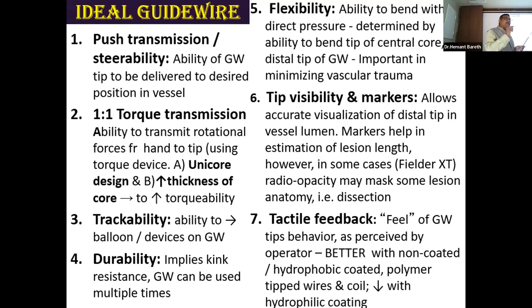That is why you have to be very careful with polymer coated wires and also a little bit with hydrophilic wires, because the tactile feel is less. You don't get that feel that something wrong is happening and maybe we are penetrating the vessel wall. That feel may not be there with the wires which don't have tactile feel.